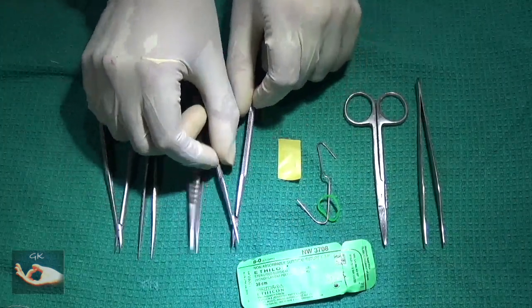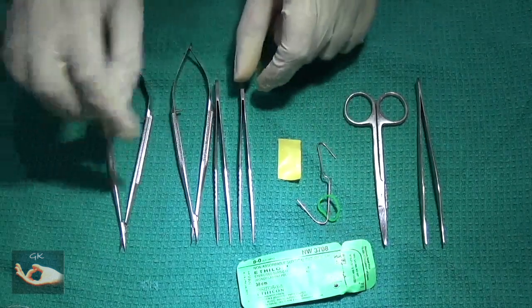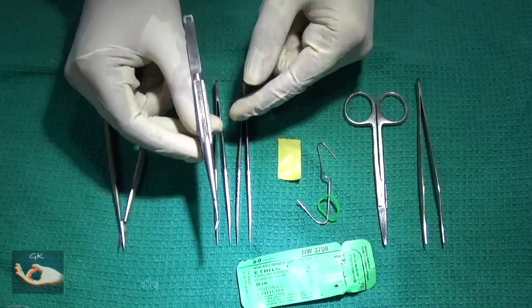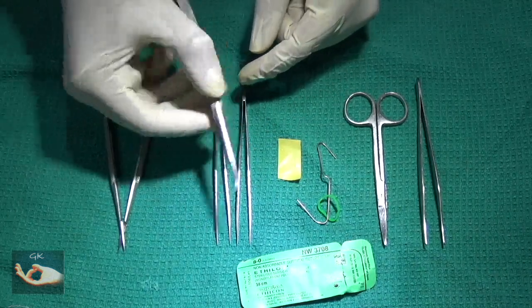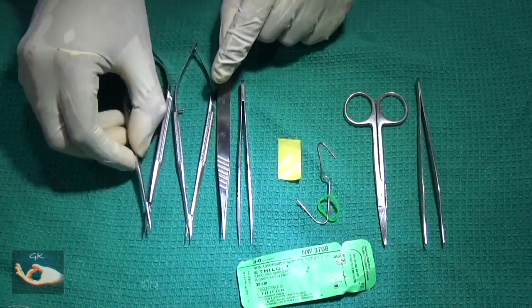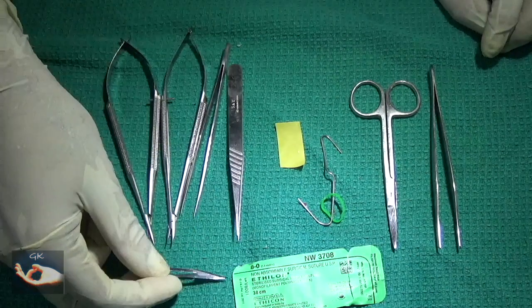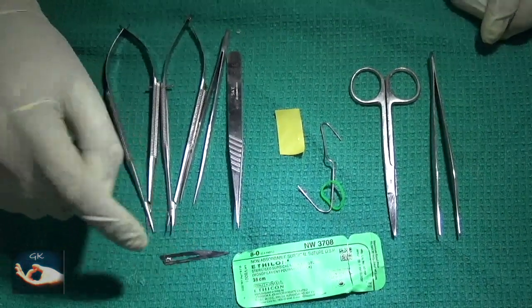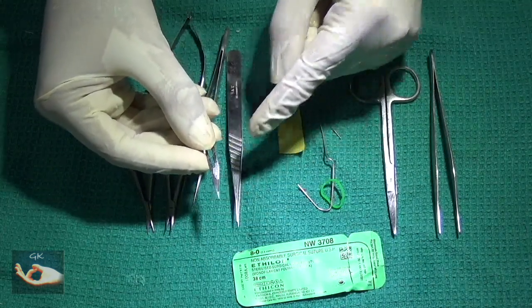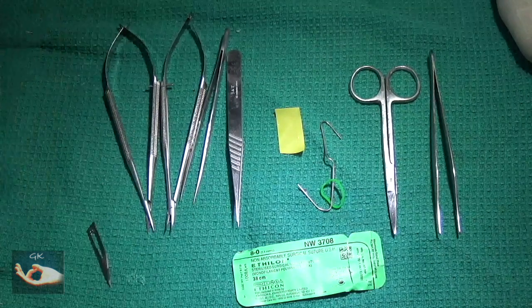Next is the background material. We will come to the micro instruments. The first is the jeweller's forceps, with which to hold the epineurium while taking the stitch. The second is the needle holder. The third is the micro scissors, which will be used for cutting the suture. We will be using the number 11 size blade for cutting the nerve sharply. The number 11 size blade has a longer cutting edge, which is why it is preferred to the number 15 size blade.